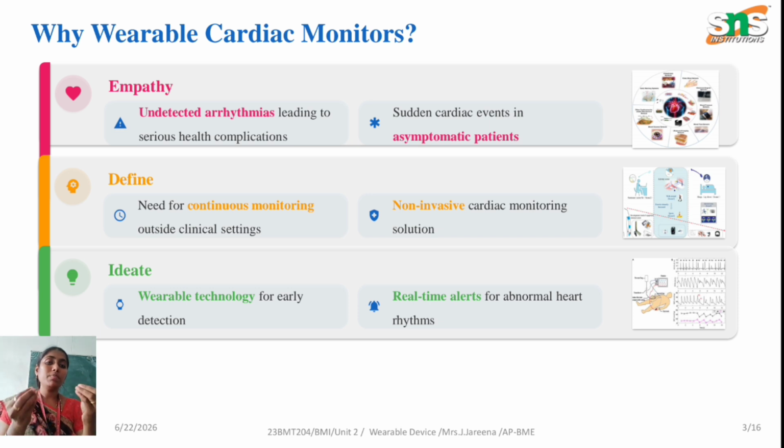There are some patients who are asymptomatic. The patient may not feel any symptoms, but at last they will end up with cardiac arrest. So if people don't have any predictable pattern of symptoms, in such asymptomatic cases we have to go with some device that monitors our body 24/7 without affecting our daily routine. That is the demand which arose to have wearable cardiac monitors in today's life.